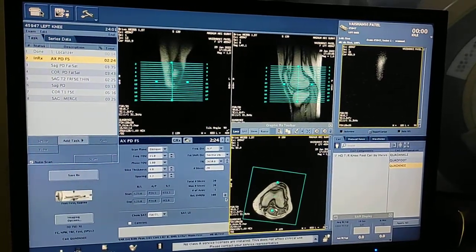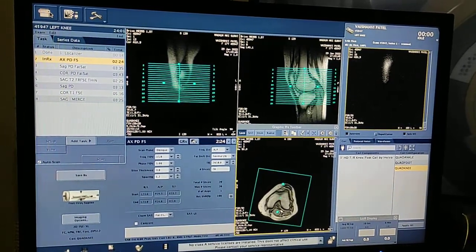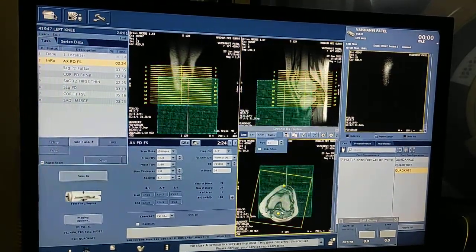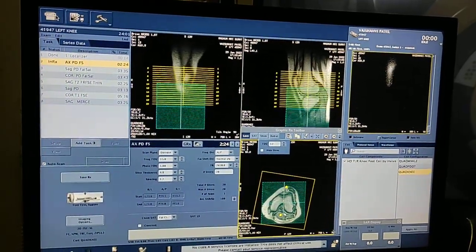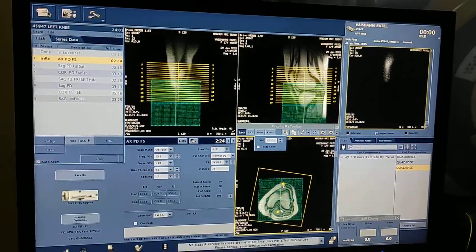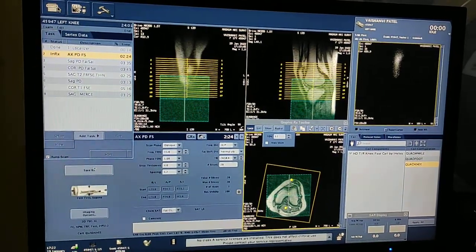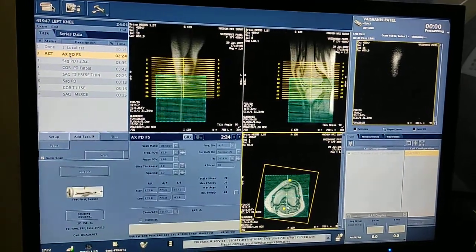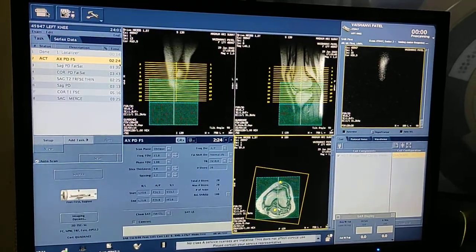After getting the axial PD, I will plan the rest of the sequences. You have to click on shim and keep the shim on the images — the shim will reduce the extra noise coming in. Reset the SNR, save RX, and start scan. The axial FS PD scan time is 2 minutes 24 seconds.